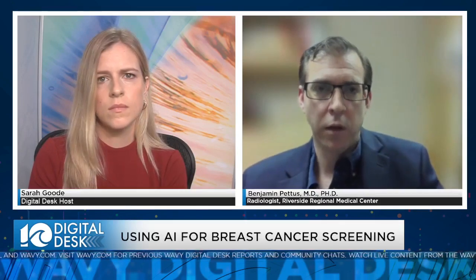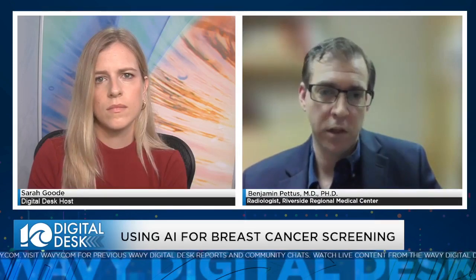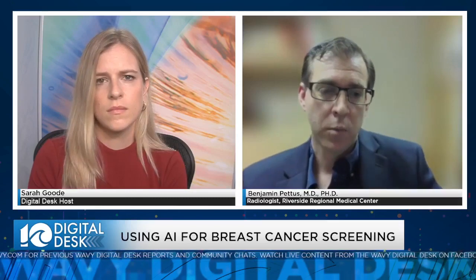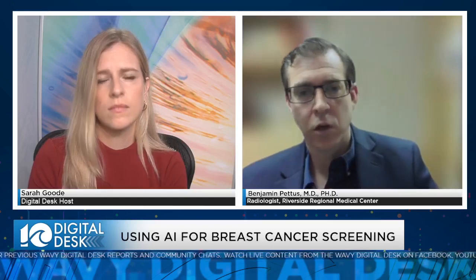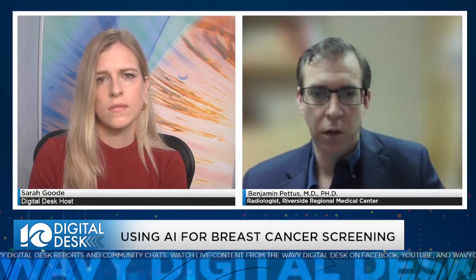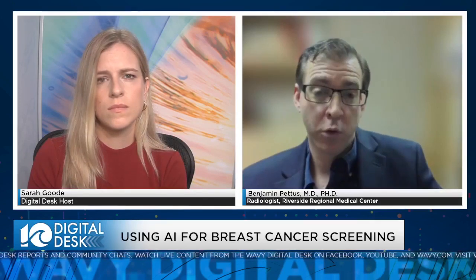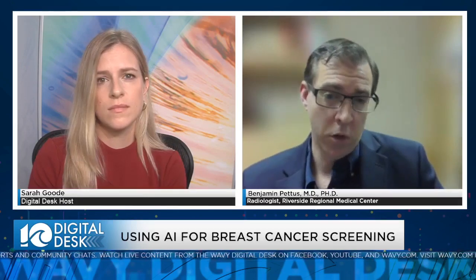But anyway, there's a threshold theoretically below which we can't see things yet, and what we're trying to do with all of these tests is drive that threshold as small as we can, because cancer is a progressive thing. You want to find it as small as you can before it does anything, but you're battling the fact that everybody's body is different, and a lot of the tissue is different. So we're trying to improve the technology from the visualization side, but also from the computer database side.